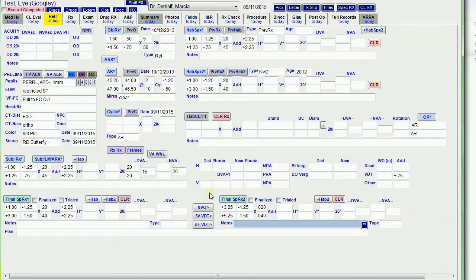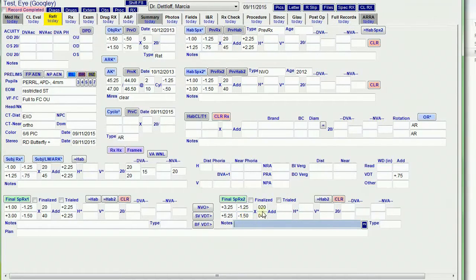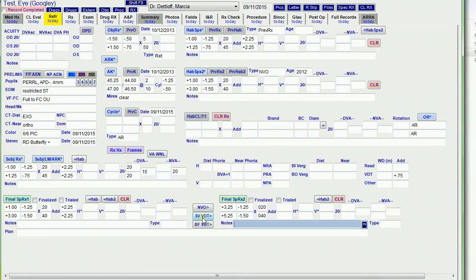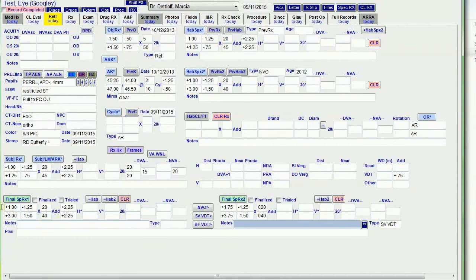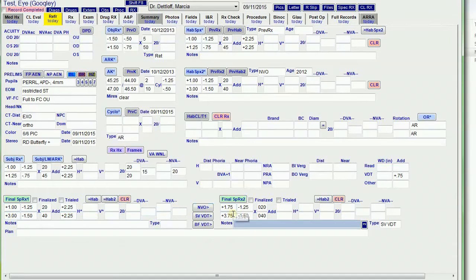If I click this button, it adds the add total to the sphere and creates a single vision reading only prescription. If I click the single vision VDT, it adds the VDT add from this field to the spherical power to come up with a single vision computer glass.